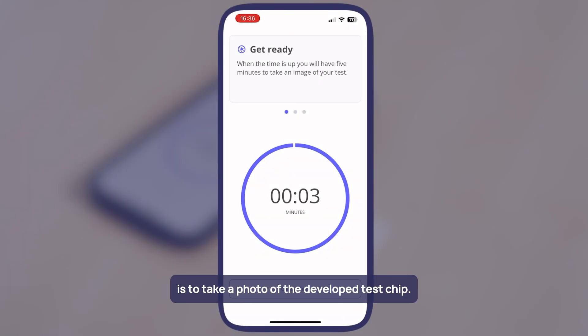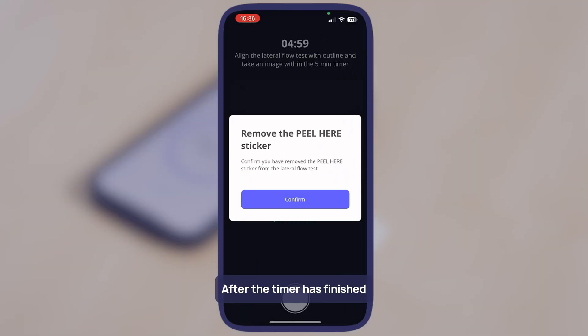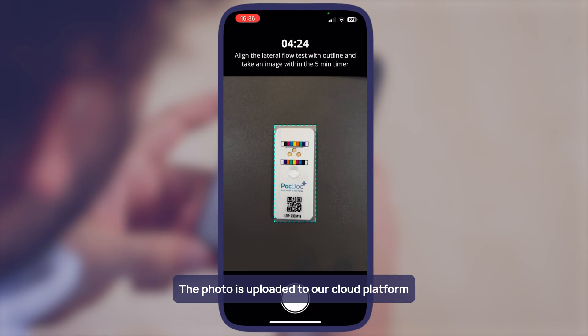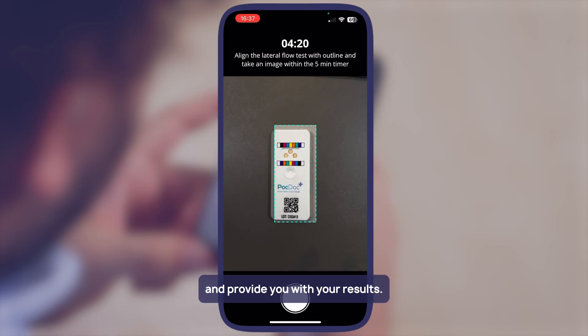The final step is to take a photo of the developed test chip. After the timer has finished, the screen will change to a camera. You have five minutes to take a photo. The photo is uploaded to our cloud platform, which will analyse the chip and provide you with your results.